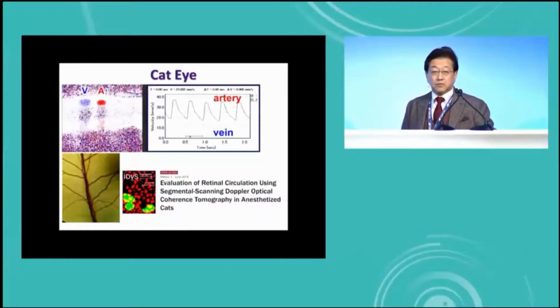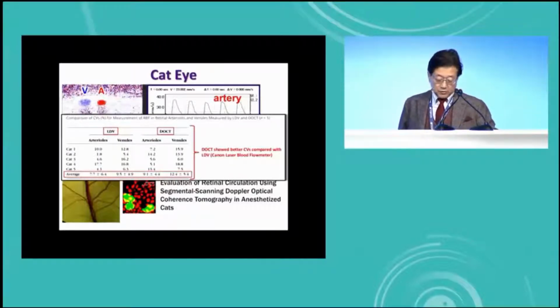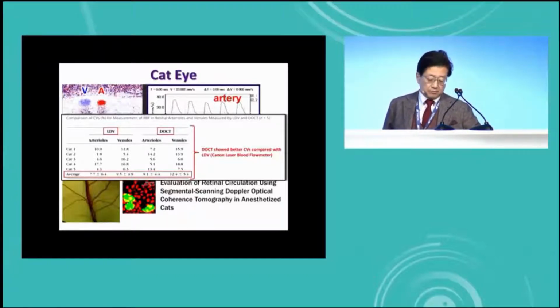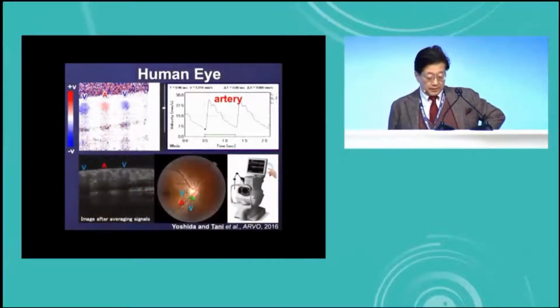And we used this technique on the cat eye first. DOCT shows better CVs compared with laser Doppler, which I invented, and Canon took the patent and made it.